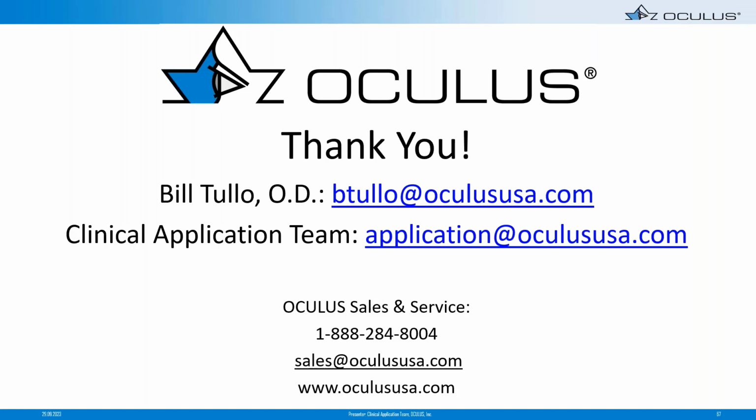Yeah, I think screening for keratoconus, the BAD screener is for abnormal eyes, keratoconus being one of the abnormalities that the Belin-Ambrosio enhanced ectasia display screens for. And I think if you measure an eye that just got out of their contact lens wear and it measures normal BAD on the final BAD measurement, even if it's an elevated number, if it's white and normal, I think you know that that patient is likely not to have an abnormal cornea.